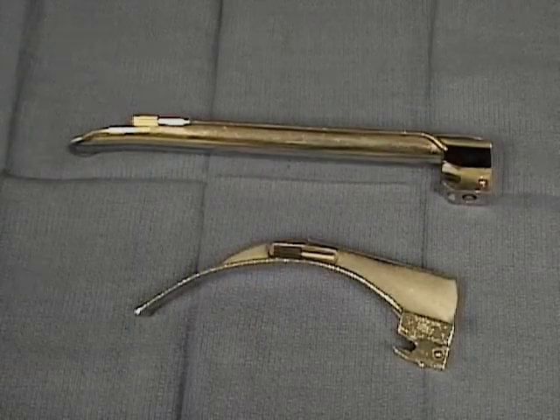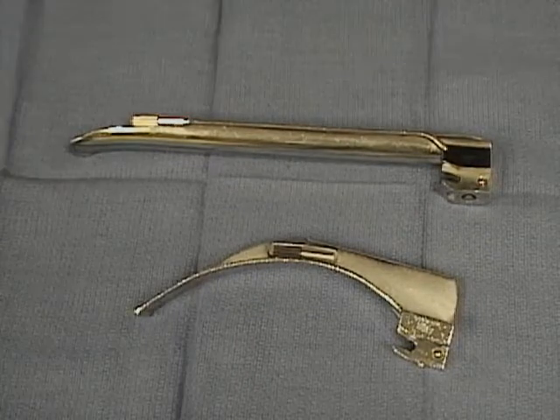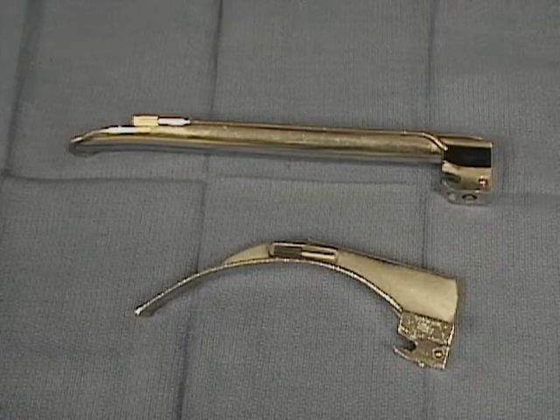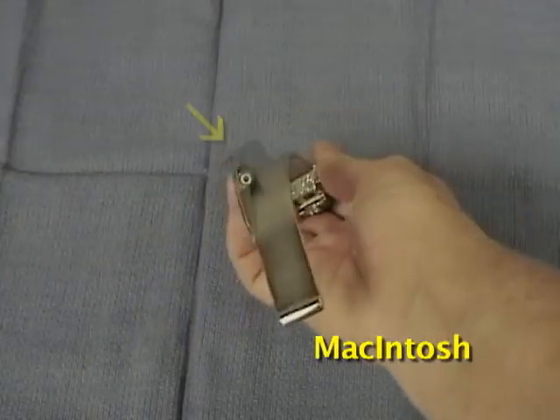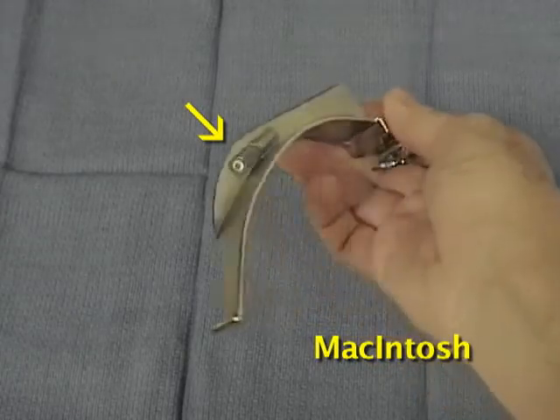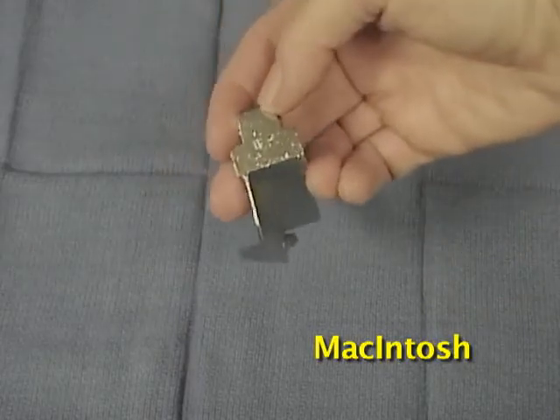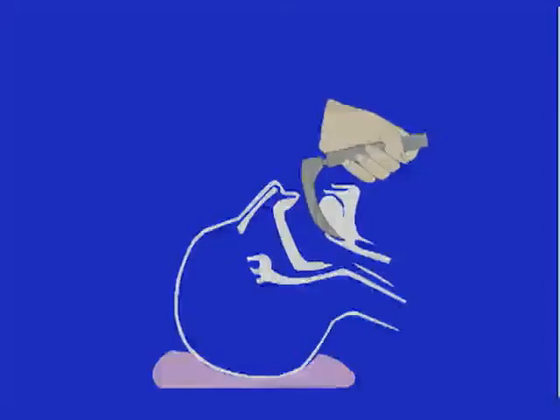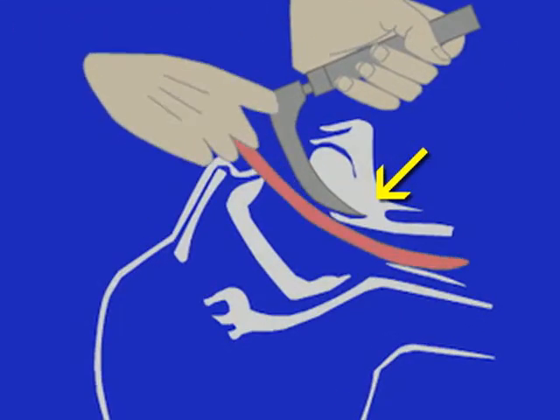There are two major types of laryngoscope blade, curved and straight. Technique used varies slightly with each, so let's look at the differences and review intubation again in the process. This is a curved Macintosh blade. Note the position of the light source, the broad, flat blade width, the tall flange for positioning the tongue, and the overall curved shape. With the tip in the vallecula, lifting the tongue pulls on tissue folds attached at its base. This lifts the epiglottis passively, exposing the cords.